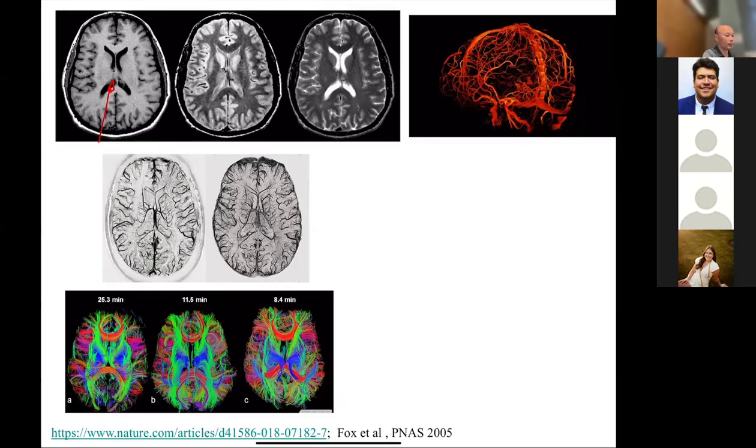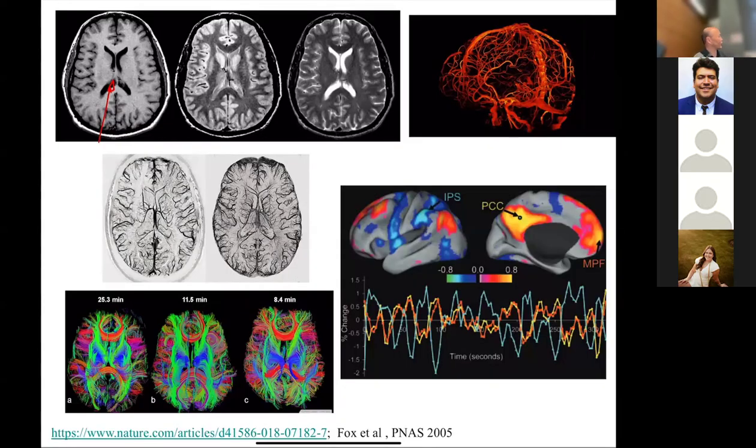All right. And the other thing you can do, which is my area of research, is I can also put you in the magnet and I can tell what your brain is doing. Okay, so this is the area called functional MRI, where I'm seeing what your brain is doing. Like if you're doing a gambling task or you're thinking about your homework or lunch, how's your brain acting differently during those tasks? And we'll talk about how that works later in the course. The hardware is all the same. Okay, it's the same MRI system. I've just changed the app. Okay, so that's pretty cool.